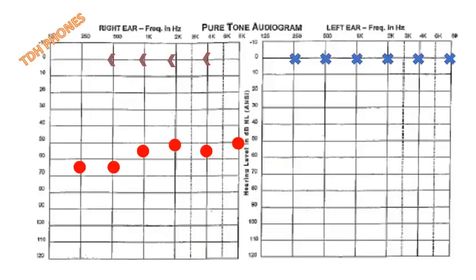What are we to make of a hearing situation like this then? Using TDH phones, we have a pretty significant hearing loss in the one ear and really good hearing sensitivity in the other. If we look closely, we see that the differences between the hearing levels in the right ear and the hearing levels in the left, or the hearing levels in the right ear and the unmasked bone conduction thresholds, exceed the min-IA values for TDH supra-aural headphones.